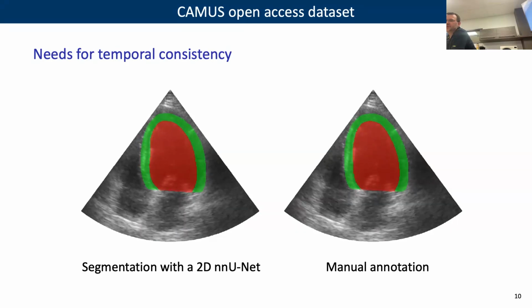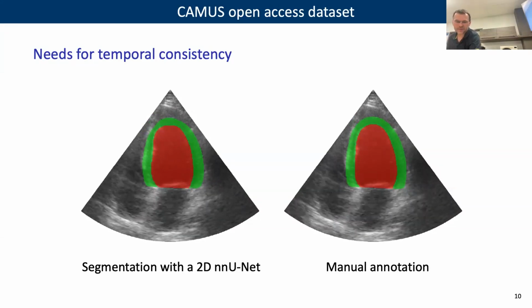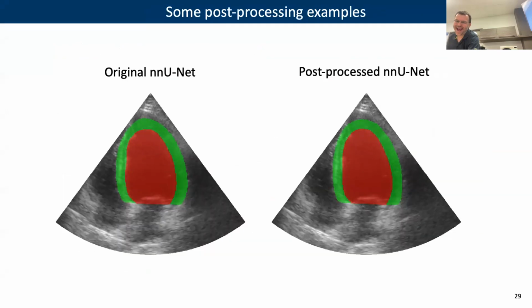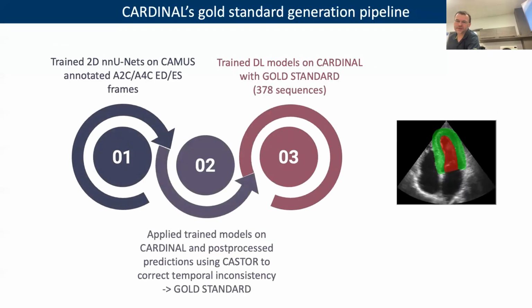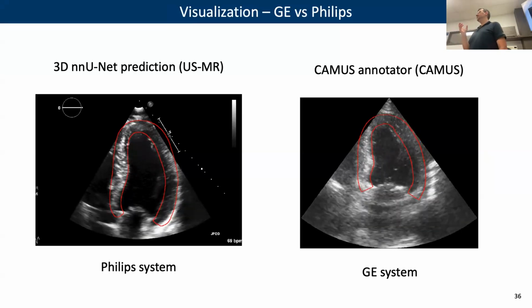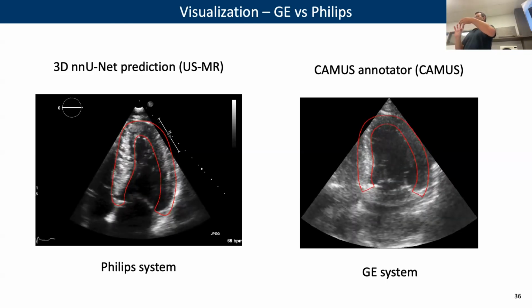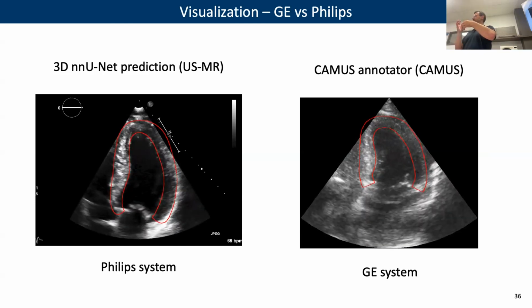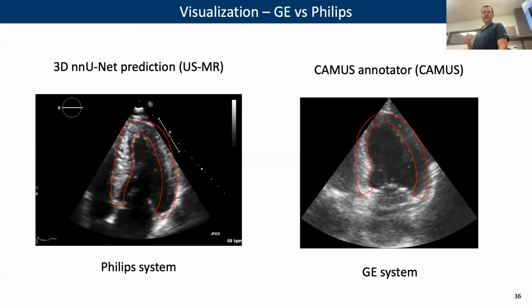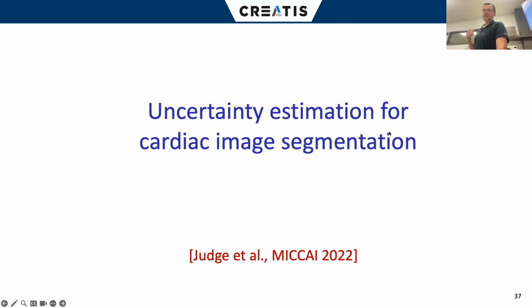I really think that the problem here is not the human, it is really what you can see in the acquisition. Is there something that the human might not be able to see that the machine could see even better? I don't think so, to be honest. Even more in 2D, of course, you have out-of-plane motion. The heart is doing exactly this motion, and so part of the structures disappears and appears. You have a lot of artifacts like shadowing that make it very difficult, and you have to guess where the shape is.